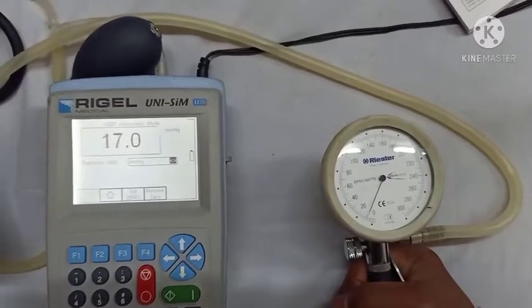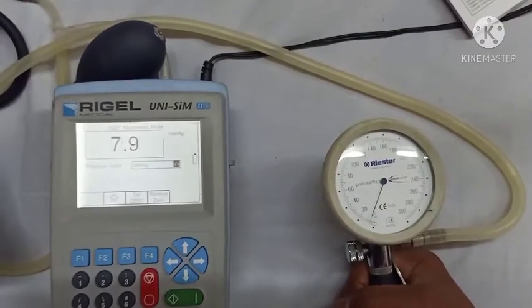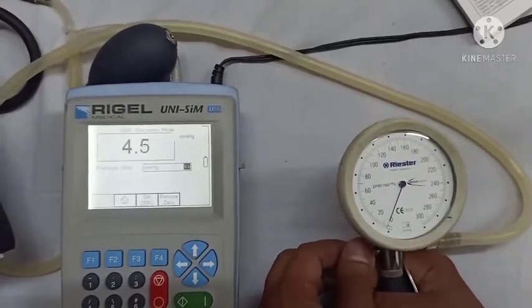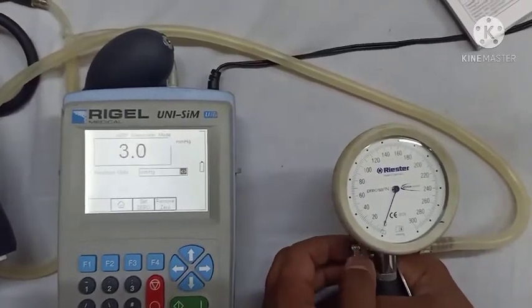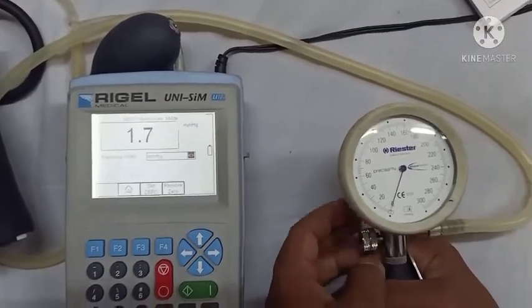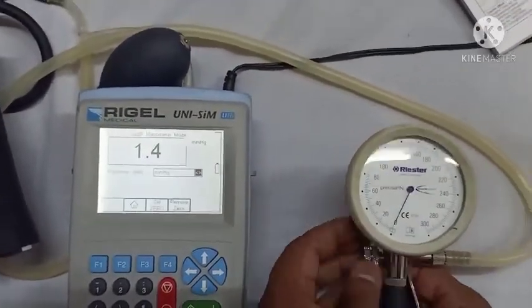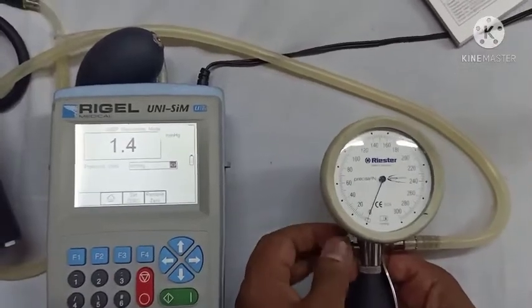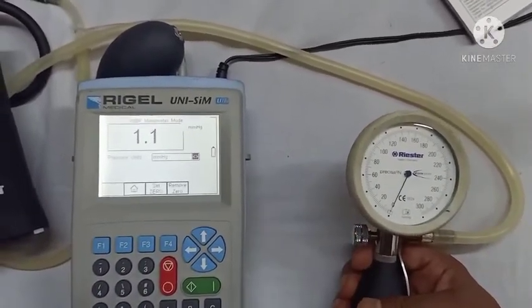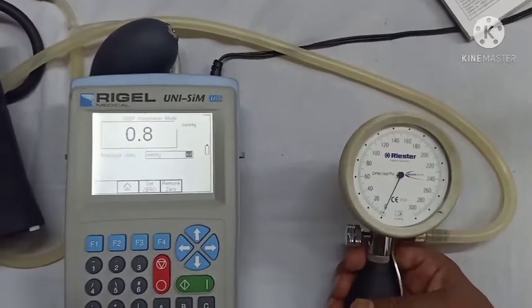Now we have started releasing the pressure completely. After releasing all the air, we will get some error or it might read zero. If it is not zero, there may be some hysteresis error, which will be further used in the uncertainty calculation of the readings.